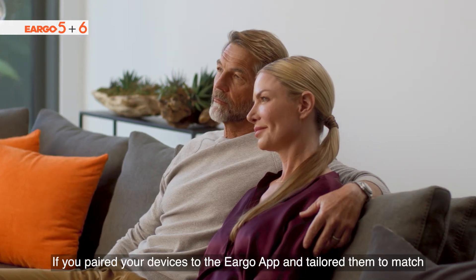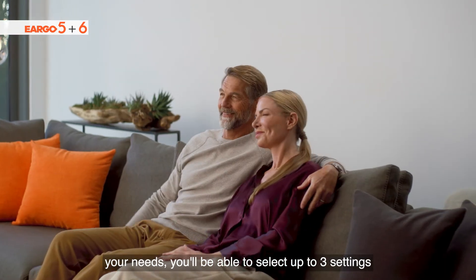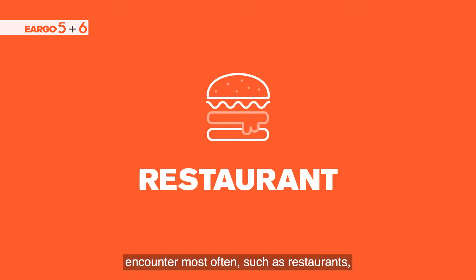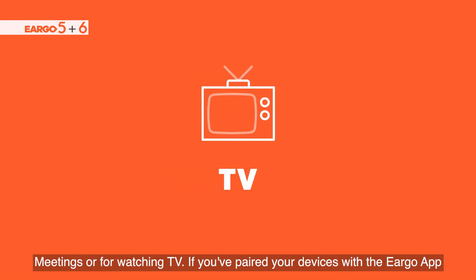If you paired your devices to the Eargo app and tailored them to match your needs, you'll be able to select up to three settings that match your listening preferences in the situations you encounter most often, such as restaurants, meetings, or for watching TV.